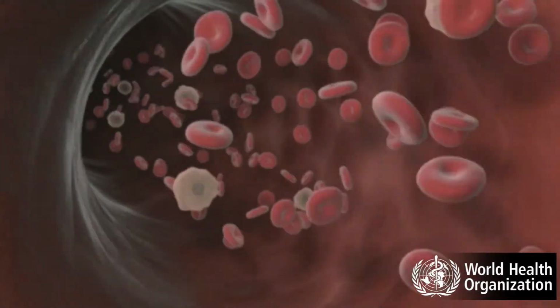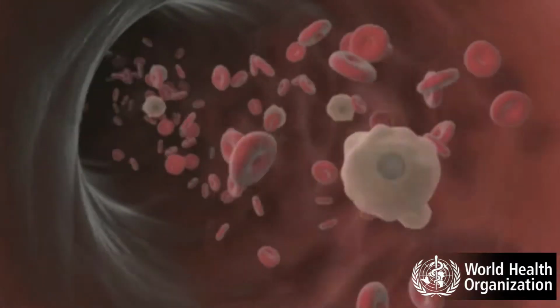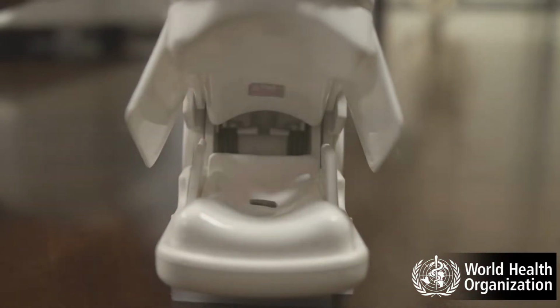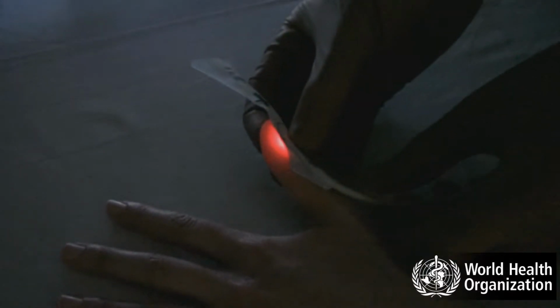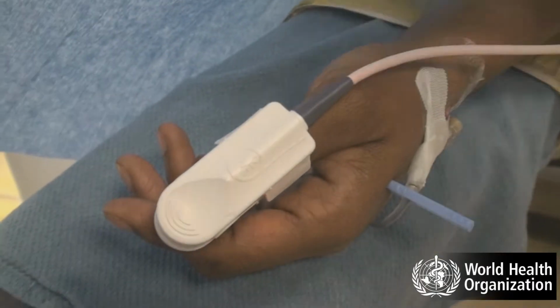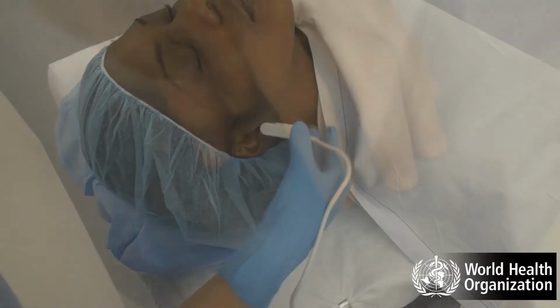In order for the pulse oximeter to function, the probe must be placed where a pulse can be detected. The light-emitting diode and the light detector must face each other in order for the light detector to properly read the amount of light passing through the tissues. When the pulse oximeter is on, a properly functioning probe will emit a clearly visible red light. Probes are designed for use on the fingertip, toe, or earlobe. There are several different types.